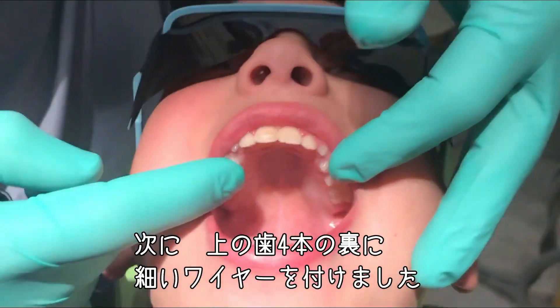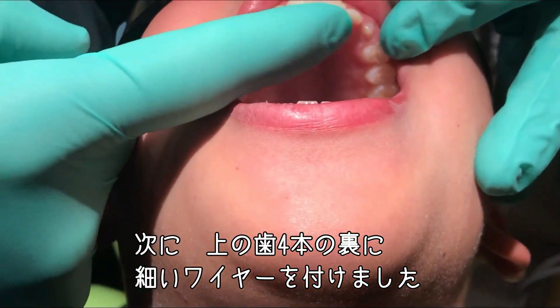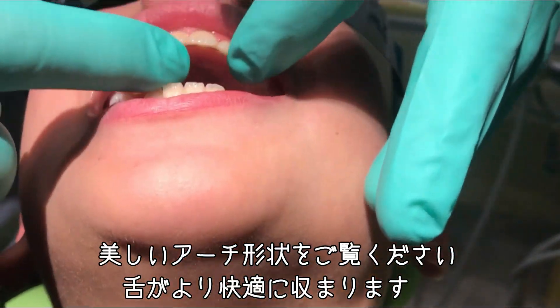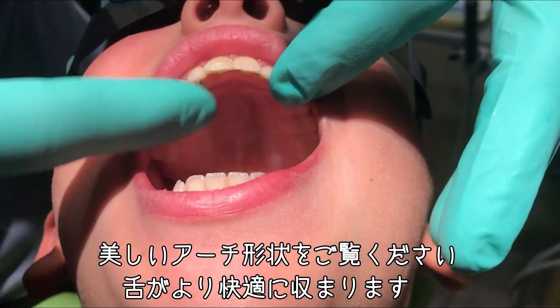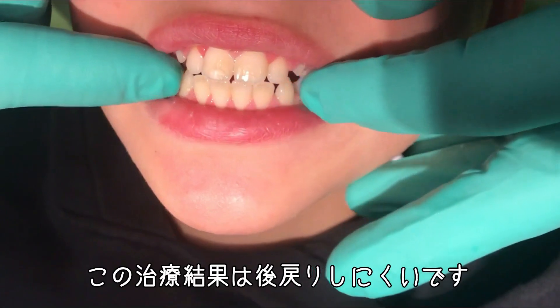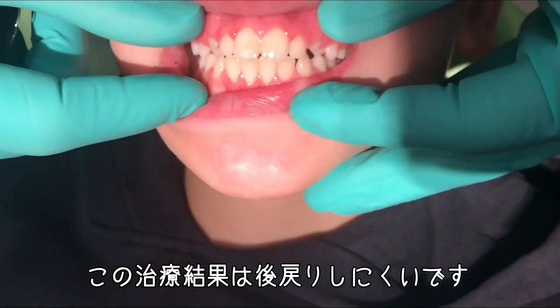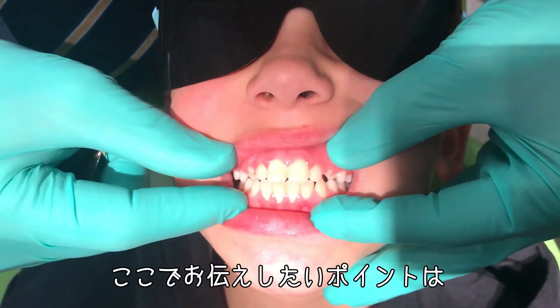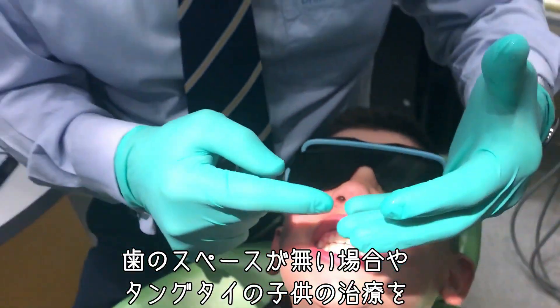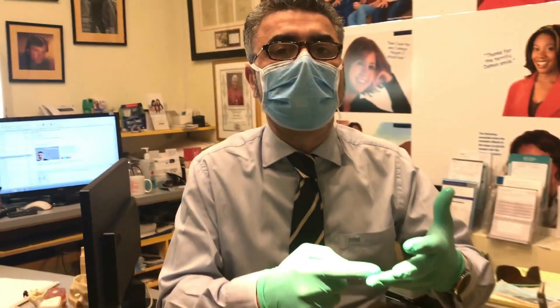Now as a plan B, just put your chin up in there. I put a little wire behind the four upper incisor teeth, right? But look at that beautiful arch form. Of course his tongue is going to be happier there. His tongue has room as well as mobility. Bite together — so that maintains the stability of the case. The point I'm making here is don't wait for children who have no room and are tongue-tied, and don't do anything.